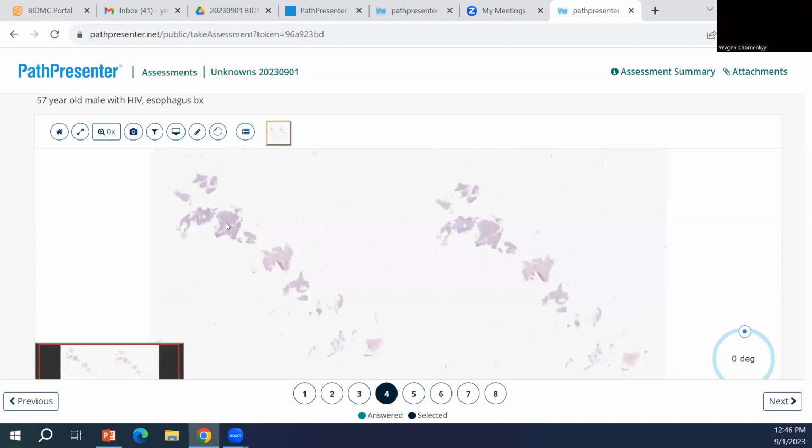The other thing I'd say is, unless I actually see inclusions, with CMV it is a different matter, right? The immunostains will show stuff that you can't see on the H&E. But with herpes, unless I see it on the H&E, I've almost never seen it on the immuno. Do you find that in other institutions? Because I find that here.